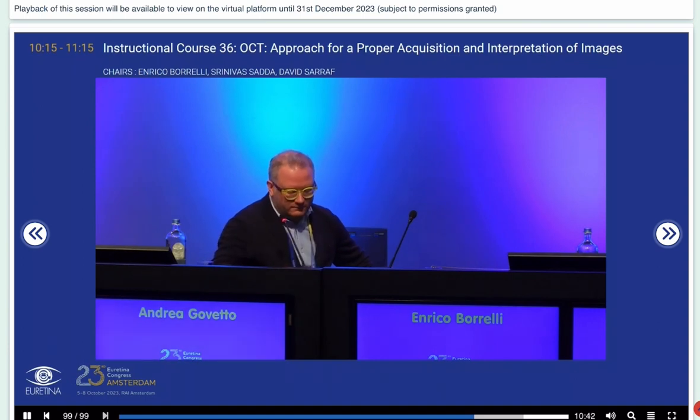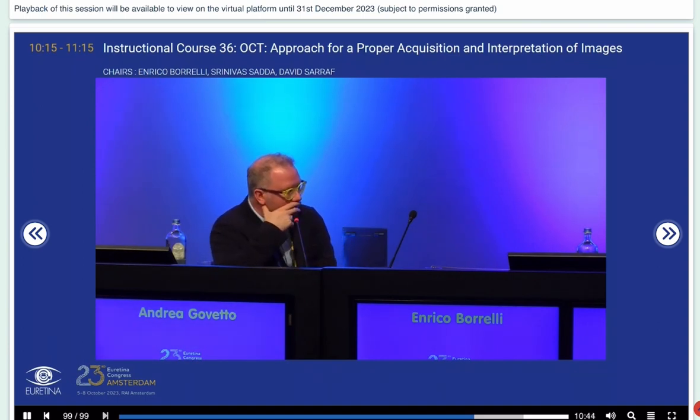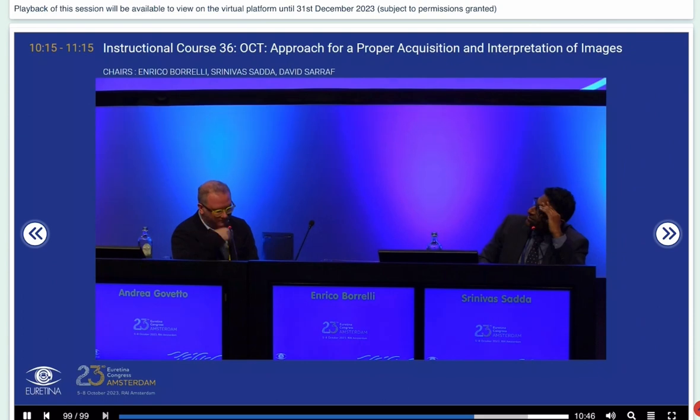Like you nicely highlighted, now that we have peripheral OCT, we are recognizing that there's traction on these atrophic, maybe even some operculated holes. We see this all the time now. So the question is, have you started to treat these now? Because obviously historically we wouldn't have, but now you have visualization and you see the traction.